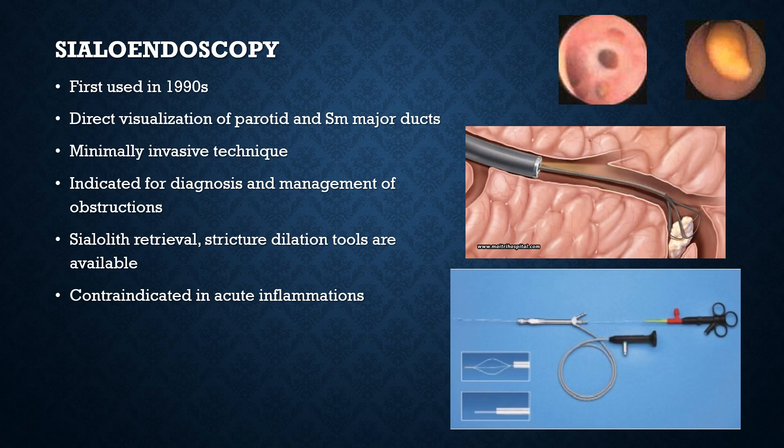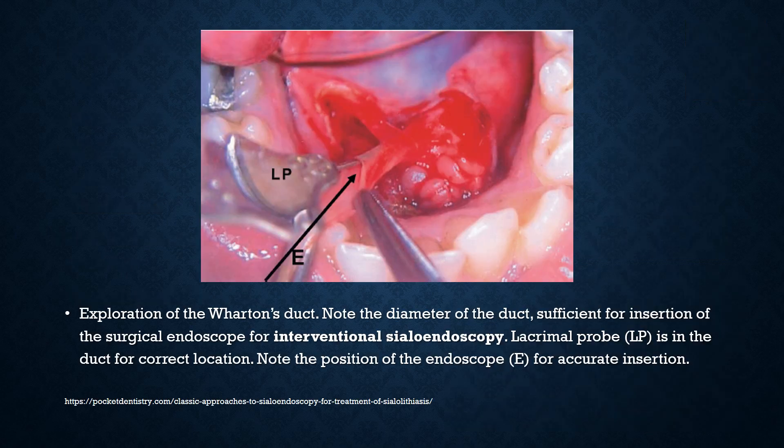Sialendoscopy is contraindicated in acute inflammations. This example shows exploration of Wharton's duct — note the diameter of the duct, which is sufficient for insertion of a surgical endoscope for interventional sialendoscopy. A lacrimal probe has been used in this duct for correct location, and it is important to note the location of the endoscope for accurate insertion.